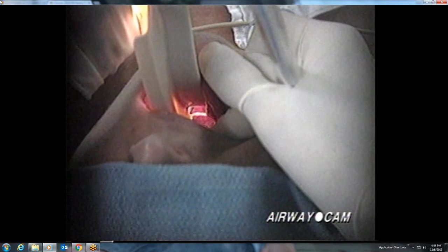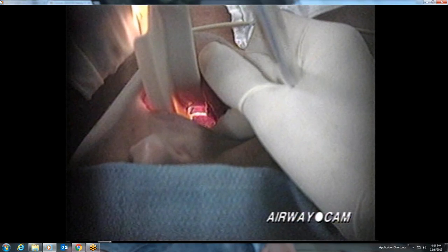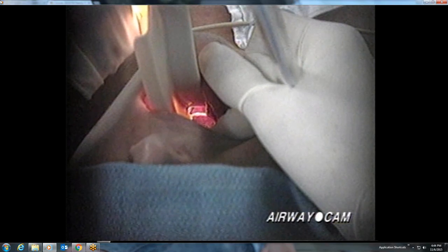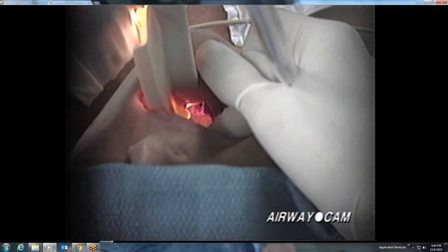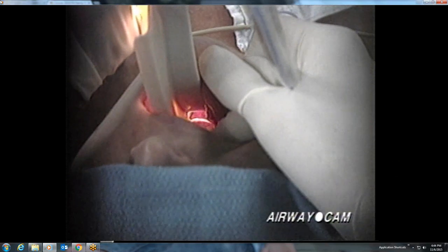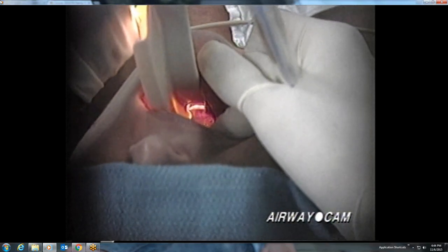Manipulation of the epiglottis with the tip of the curved blade is so important that we will review it again in slow motion. The tip of the curved blade can be used to pick up the epiglottis directly, but it is designed to sit in the vallecula, where the base of the tongue and the epiglottis meet. Firm pressure at the hyoepiglottic ligament causes the epiglottis to flip upward and expose the larynx. This is best achieved by directing the upward force on the laryngoscope in the direction of the handle and not backwards onto the teeth.